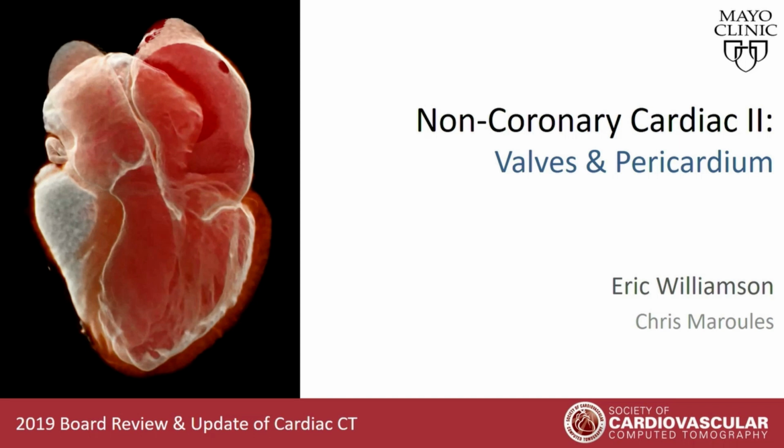And structural heart disease is one of those real revolutions that is occurring. And if you aren't very involved in this, or if this is something you don't do at your site, or you're thinking about getting involved, as a couple of the people I've talked to over the course of this session, I would encourage you to do it. There's a tremendous amount that cardiac CT has to add to the practice of medicine with regard to the evaluation of structural heart disease. It's an incredibly exciting time for us in the field of cardiac CT.